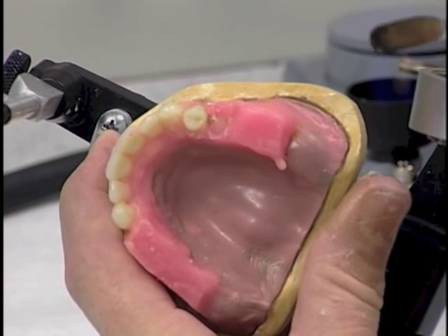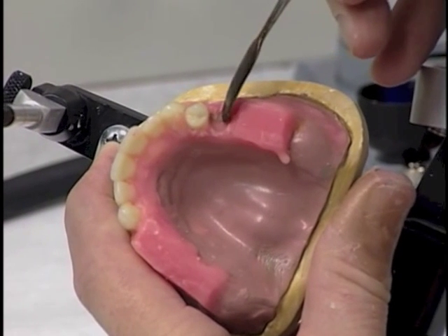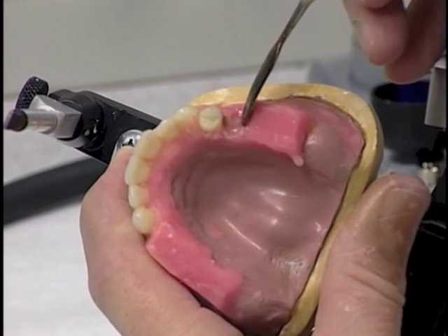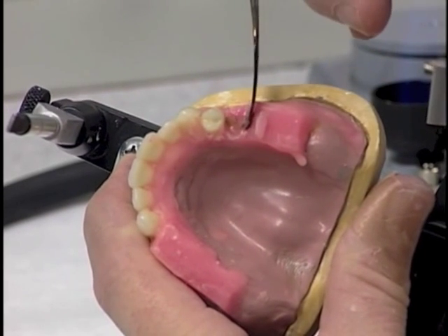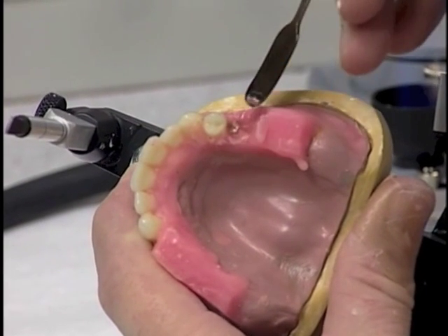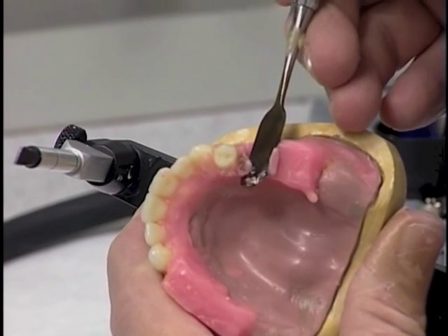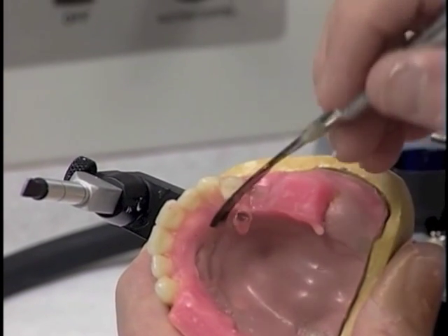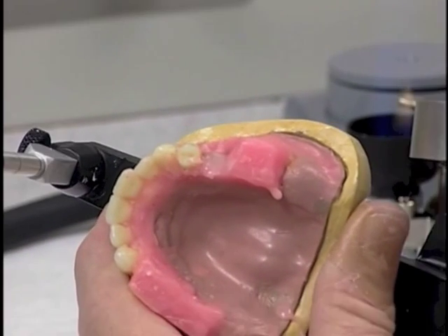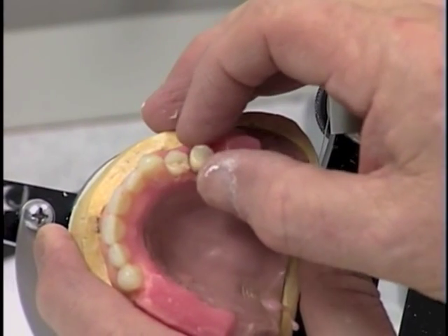The base plate, which is a shellac base plate, is interfering with the vertical placement of the tooth. Well, since this shellac is a thermoplastic material, we can take a hot spatula and actually remove some of that material. Now let's see if we can get that premolar to go into place like we wanted it to be.